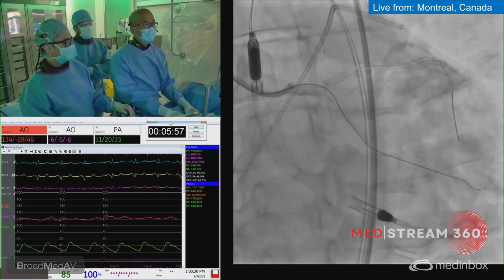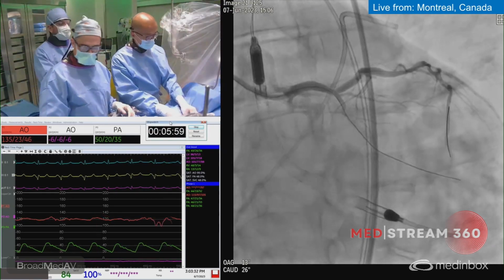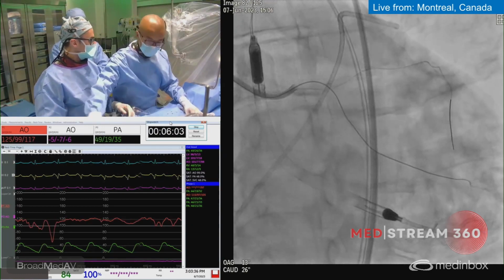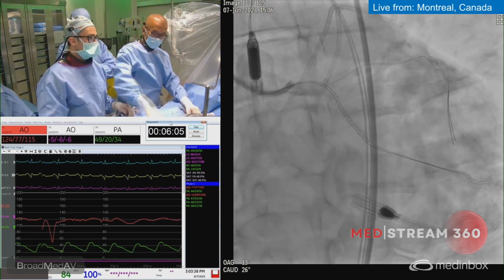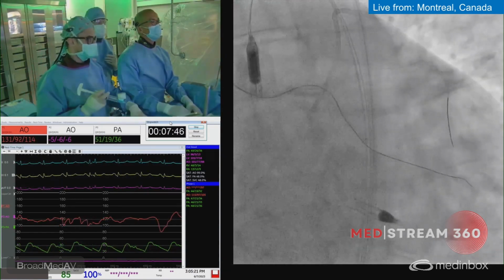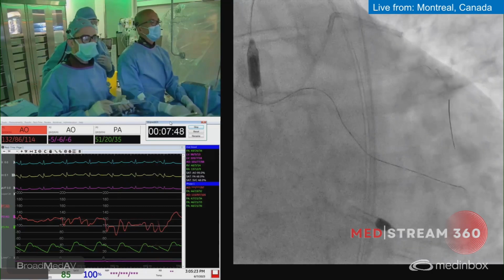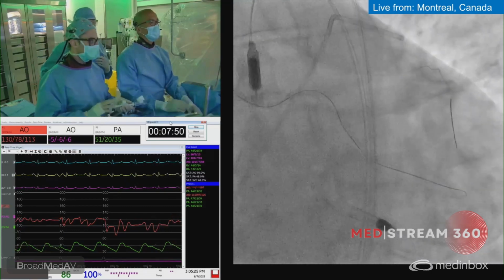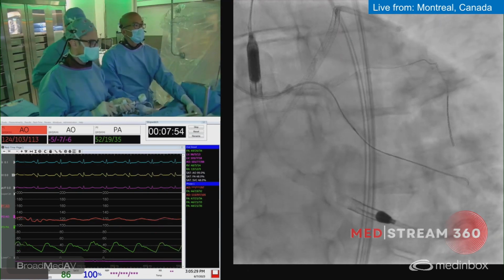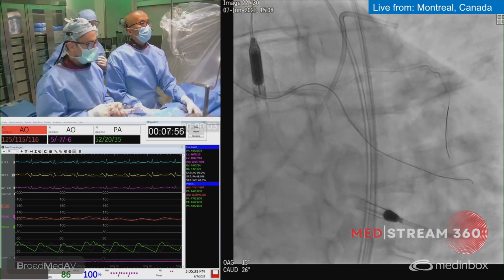So you're connected with the other collateral. Okay. So that's very good. Let's maybe start with a small balloon and do the circ first. I would do the circ first, get it out of the way, then deal with the LAD, and then deal with the bifurcation. Now the balloon is going in, and it's through. So many things that we can do up to now at this point is obviously balloon. You see the chunk of calcium.